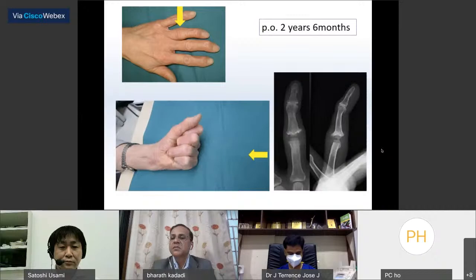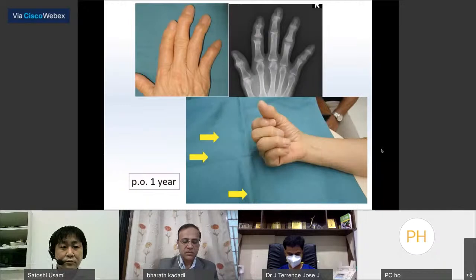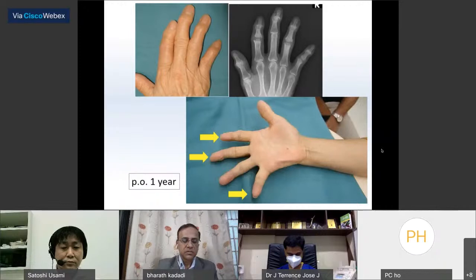Next case is a 71-year-old woman with right index, ring, and little PIP joint osteoarthritis. These three joints were replaced with Integra implants. Before the surgery, PIP range of motion of the index and ring fingers was restricted. However, at a short follow-up of 1 year, range of motion of the replaced joints had become better than before the surgery.